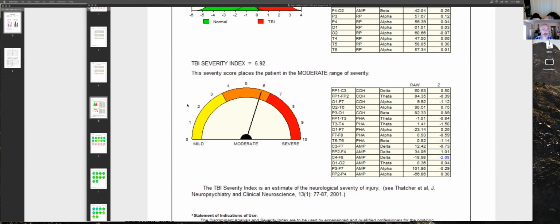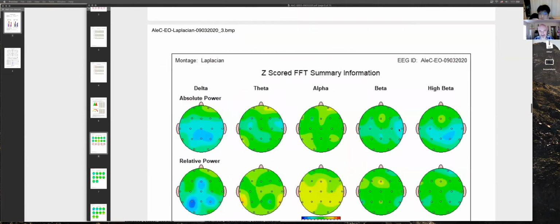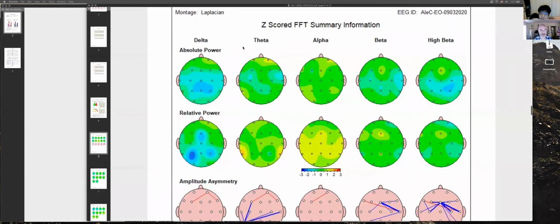Now here we open your eyes, see it says EO, and mostly all of the red is gone. It's really quite nice actually. Now we see some blue, which is fatigue, just tiredness. Is beta the highest frequency of them all? Yeah, this one here. Beta is basically actively doing things.